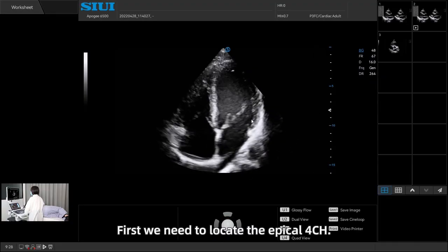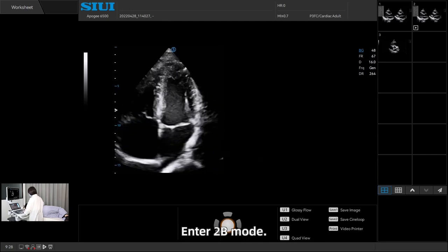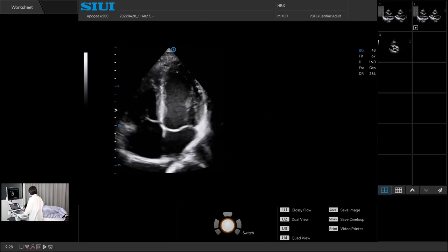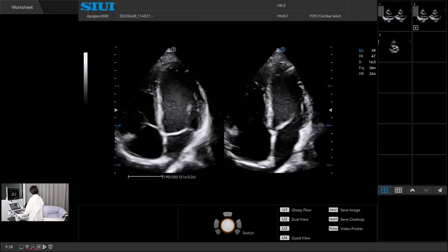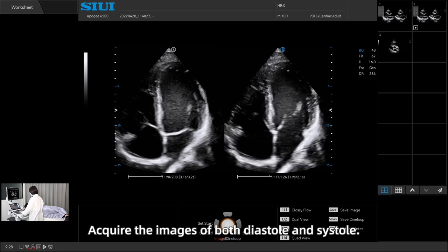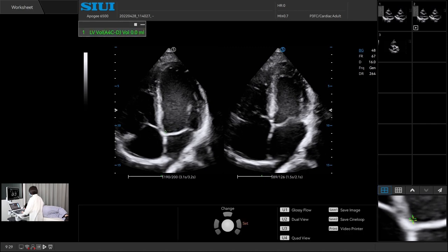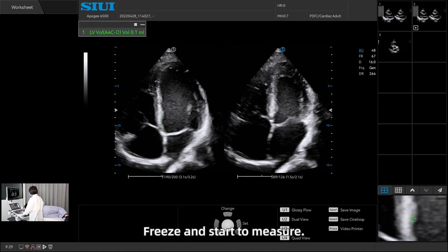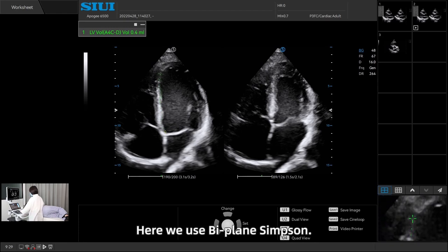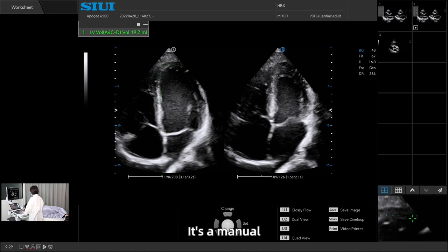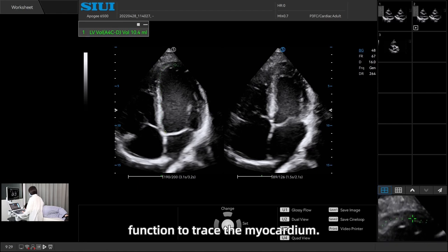First, we need to locate the apical four chamber. Enter 2B mode. Acquire the images of both diastole and systole. Freeze and start to measure. Here we use Biplane Simpson. It's a manual function to trace the myocardium.